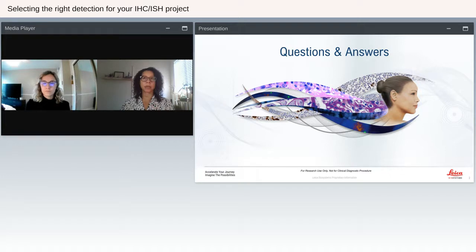Another thing would be checking the protocol. So if you have a protocol that you've gotten from literature, or that is listed with the technology that you are considering, make sure that your instrument is capable of doing the things that are needed in that protocol. So is it going to require heat? Heat is a big one. Can your instrument heat within the protocol that you are trying to use? So I would say those are the two biggest concerns. Mixing of solutions, is your instrument capable of mixing solutions, and also heat being included in the assay that you're running. Is it able to heat?